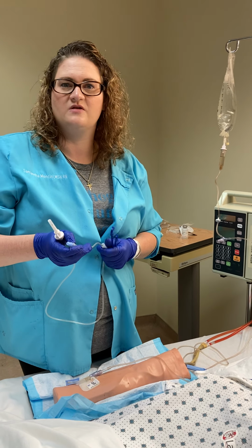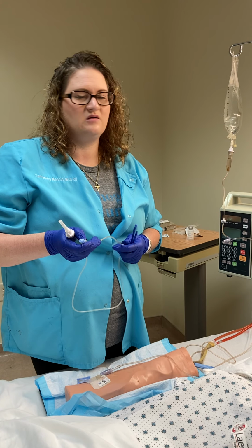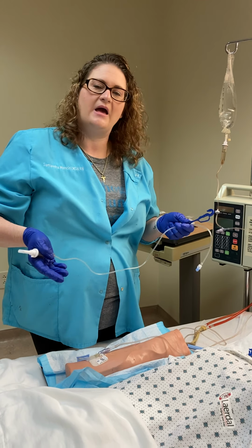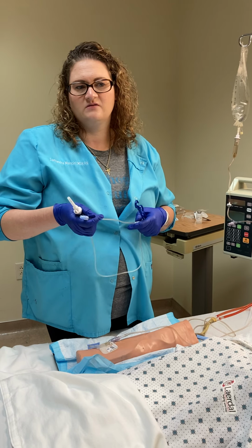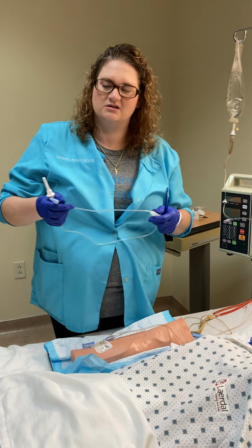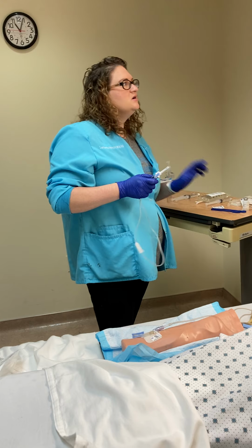And then some other types of medications sometimes. Let me see an example. In palliative medicine, we would dilute 50 milligrams of Benadryl in like a 25 ml bag. Or we would give some of the kind of sedating medications diluted, and then we would have that slowly piggyback, so we had better control of the time on that.